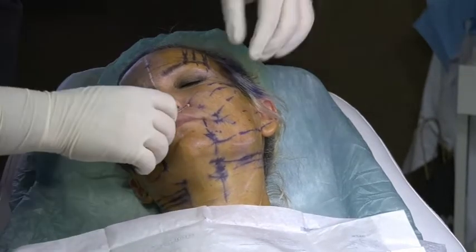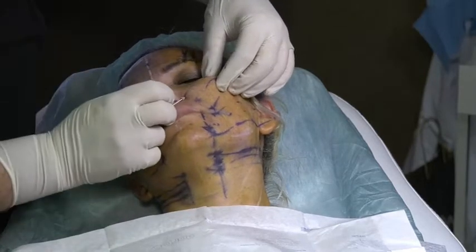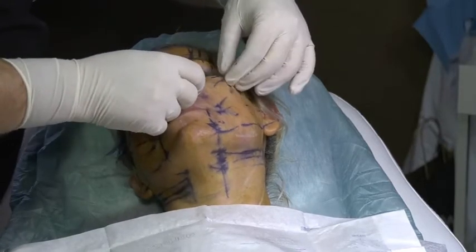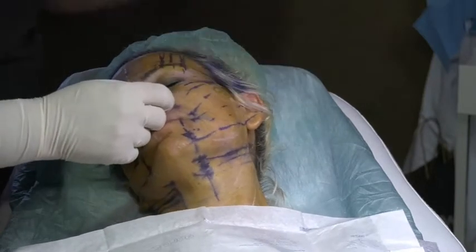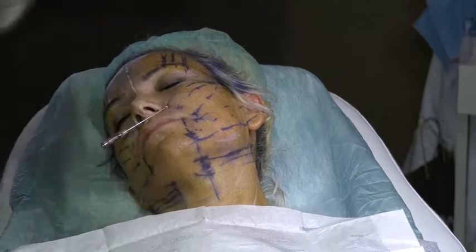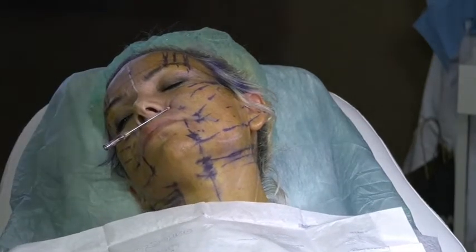Stage 2 again. Drive with soft support, but drive from up to down, not from down to up to down. Collect your skin with these 3 fingers. Your finger is standing, not sleeping. You have to see. So the patient, if it is in this position, I cannot work. She has to be like that, so I can see. Okay?